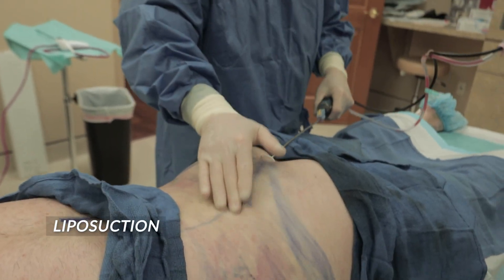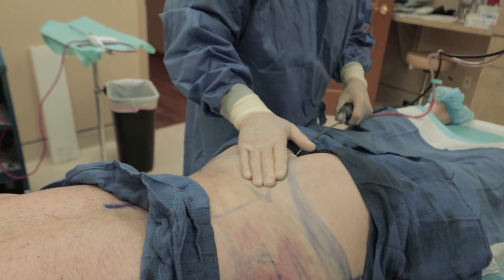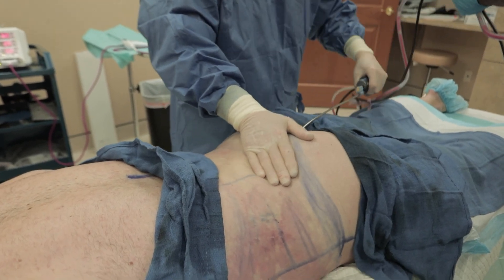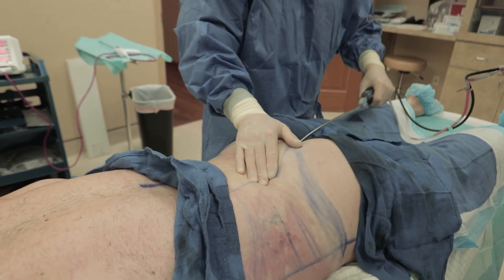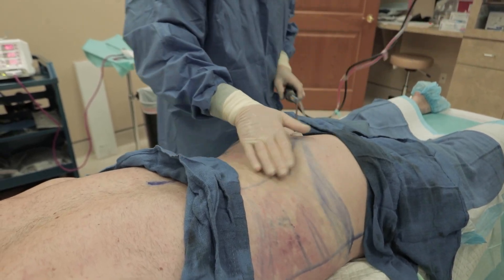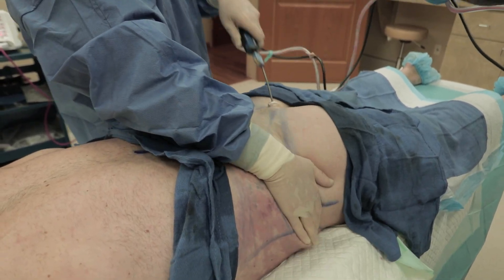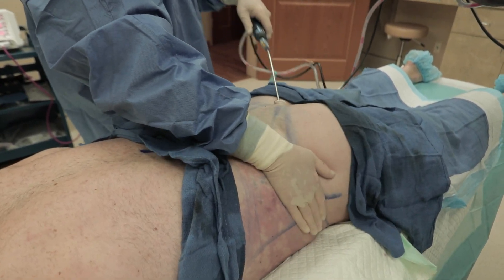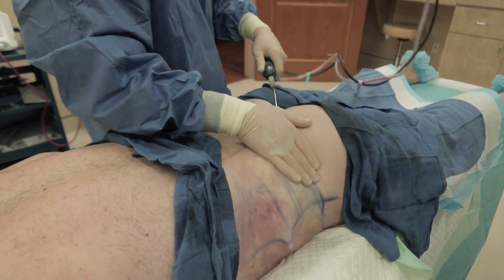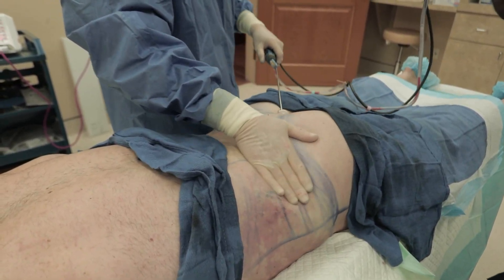I'm working on the Venus dimple on the left side. Yeah, that's the central triangle. Now that Christmas tree back — oh, that's it. When you get shorter, your back, look at that Christmas tree. I'll get that Christmas tree. I'm going all the way to the front, getting around the gluteus maximus and the gluteus medius.